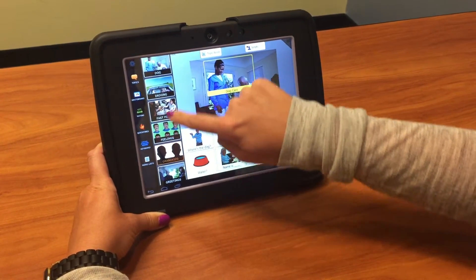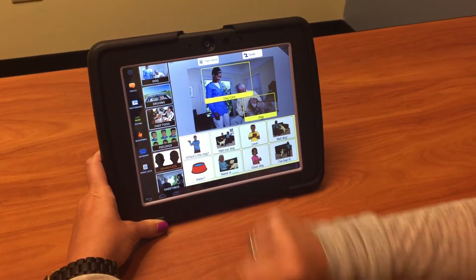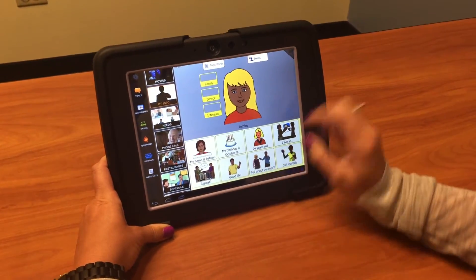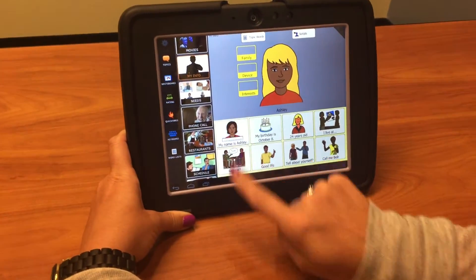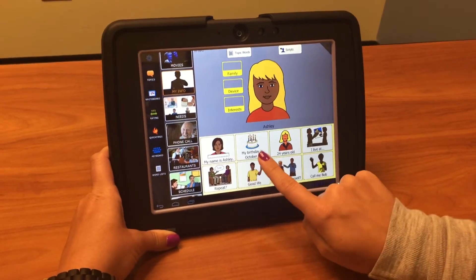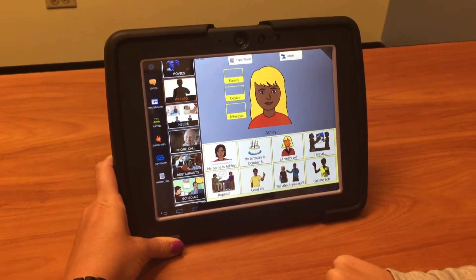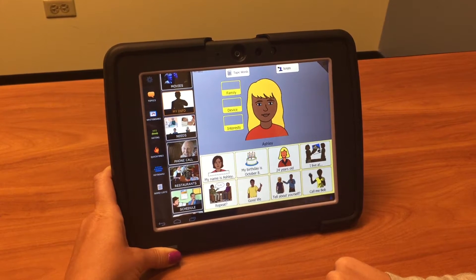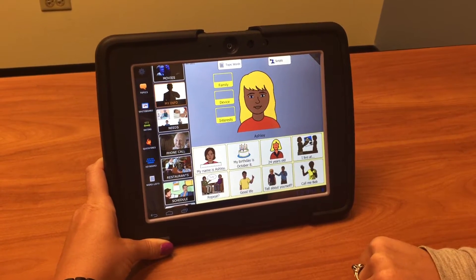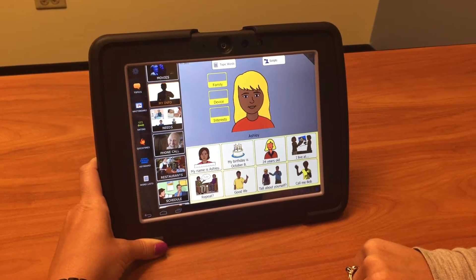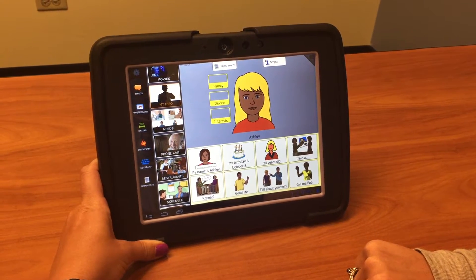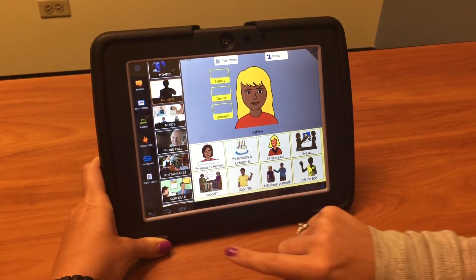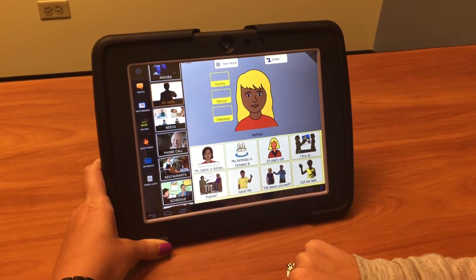So we're going to go into My Info. Here I've programmed my personal information. My name is Ashley. My birthday is October 8th. I am 24 years old. I live at 9924 South Oakley Avenue, Chicago, Illinois. And if for some reason I didn't understand what somebody says, I can say 'Will you please repeat that?'